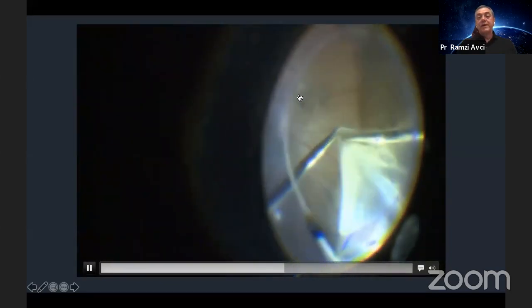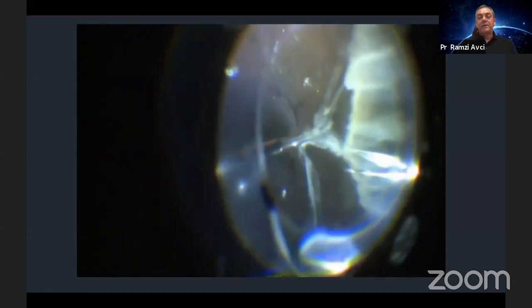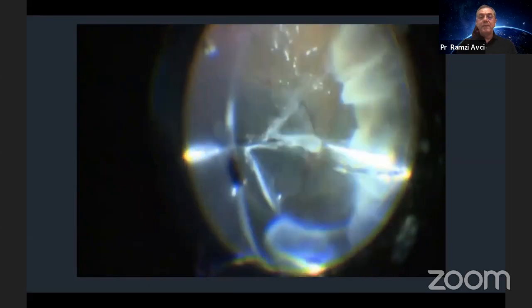Again, pay attention to cover the macular area with the ILM flap as a single smooth layer to prevent insertion of ILM into the hole, because I believe that if we keep the hole area free from ILM, it may provide better regeneration of the retina and better functional results.